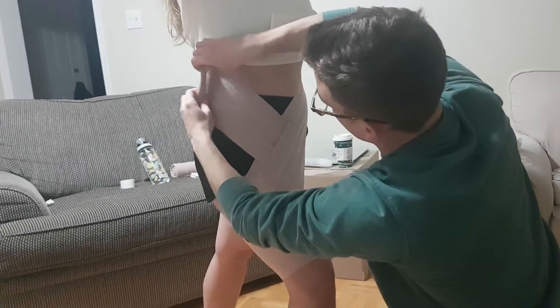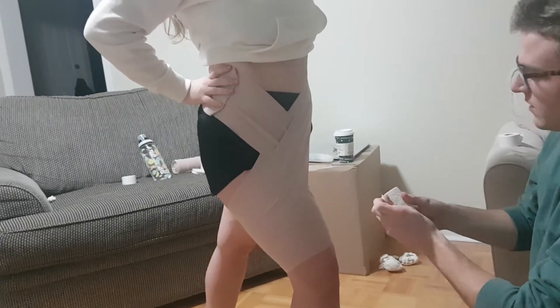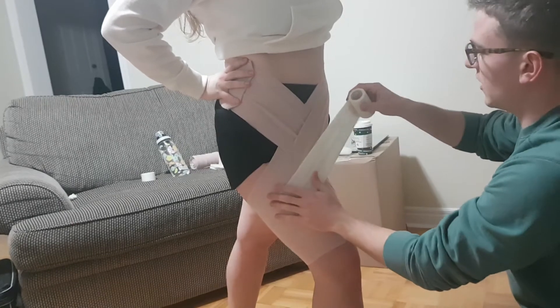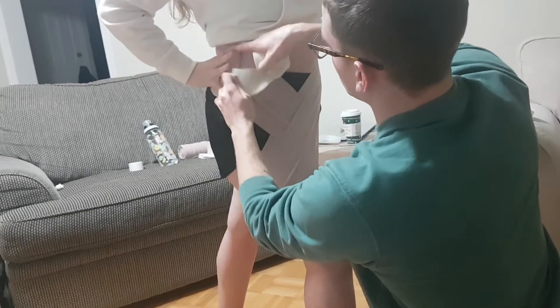I'm at the end of my tensor here, so can I just get you to hold here? I'm going to take Ultralight tape and just follow that same pattern around. Make sure to hold it on. I'm going to start where her hand is, so you can just move your hand back a little bit.